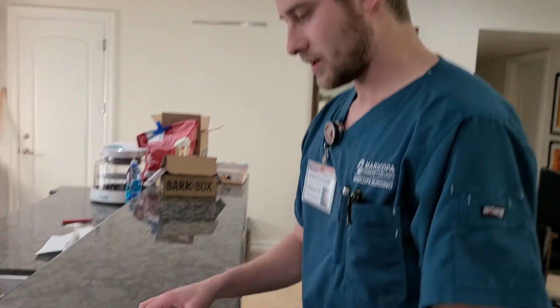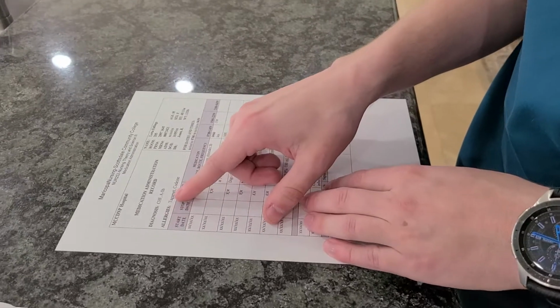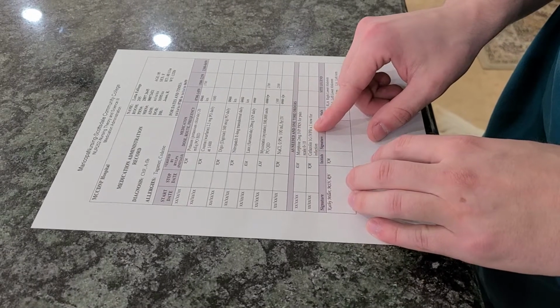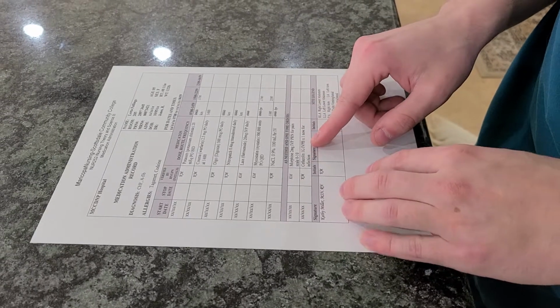This is my IV piggyback skills video. So we have our MAR here. We have patient Lotta Fallings, date of birth 10/5XX. We have allergies of Tagamet and codeine, so we'll make note of that. We currently have an order for cefazolin, 1 gram IV piggyback times 1 now for infection. We're giving it at 0800 hours and we're giving it over 30 minutes.